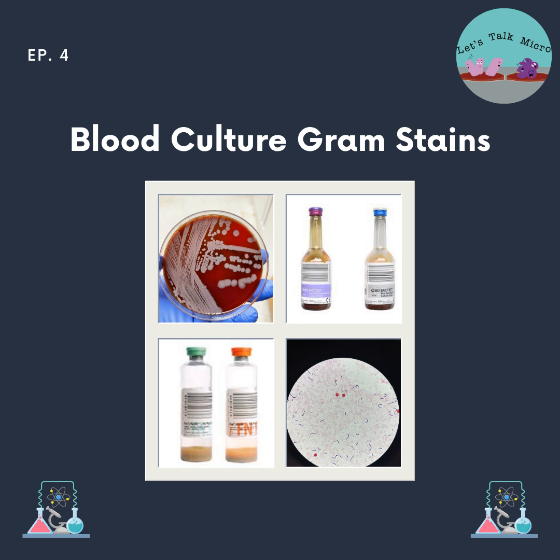And I just want to add about the NOS. Before you report it internally as NOS, before you stick it back in the incubator, there are two things that I want you to do. Look over 50x. Sometimes, you might miss a yeast. It gives you a wider field of view. And do a cytospin slide. Sometimes, you might have a low amount of organisms. And by doing the cytospin slide, you're able to concentrate it and you're able to see it better.